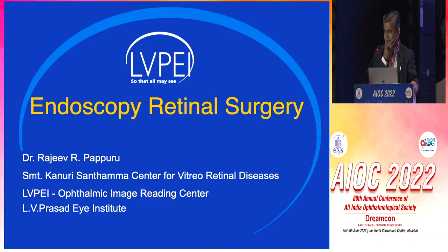So we have a few talks based on what are the instrumentation and different ways of using and different clinical scenarios where we can use the endoscopic vitrectomy. So the first talk is going to be on instrumentation, what are all the instruments which are required where we're going to do an endoscopic vitrectomy.